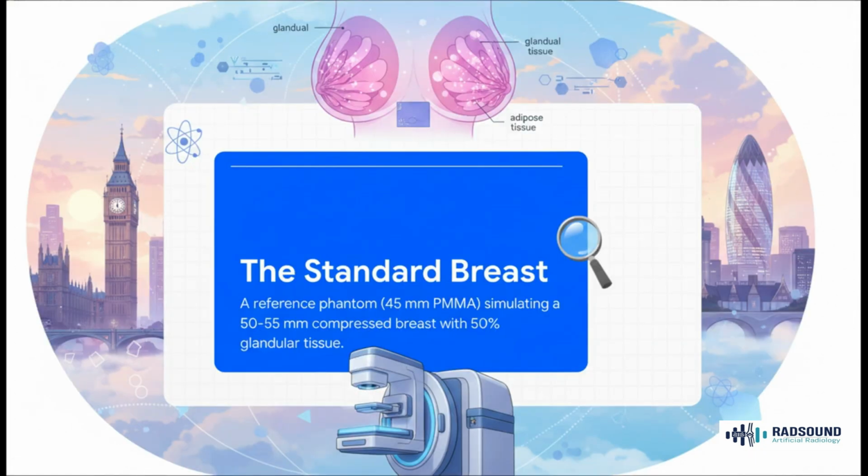Now, to make sure we're all playing by the same rules, so a machine in London can be compared to one in New York, we need a universal benchmark. And that's where the standard breast comes in. It's not a real breast, of course. It's a phantom made of 45 millimeters of a plastic called PMMA, and it acts as the perfect stand-in for an average breast. All our reference levels and safety checks are based on this guy.